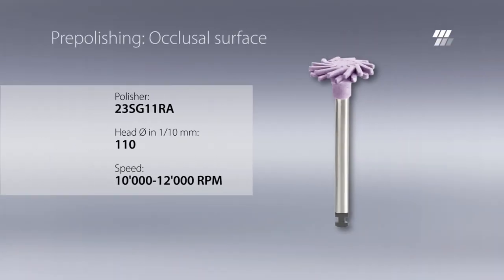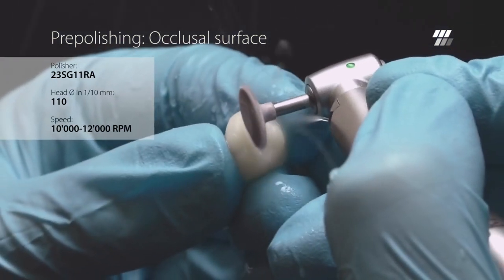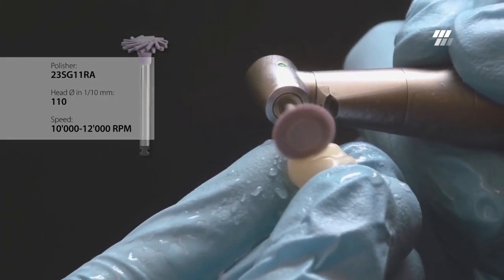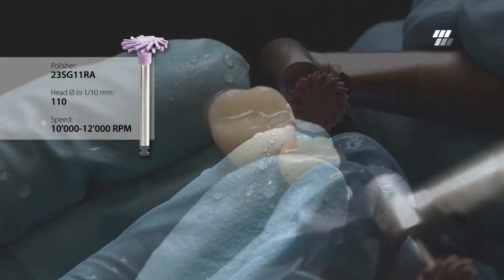As a first step, pre-polish the composite with Diatek ShapeGuard Comprapol Plus. Use the head diameter of 11 millimeters to pre-polish the occlusal surface, especially fissures and cusp slopes. The flexible lamellas of ShapeGuard adapt perfectly to the shape of the crown.